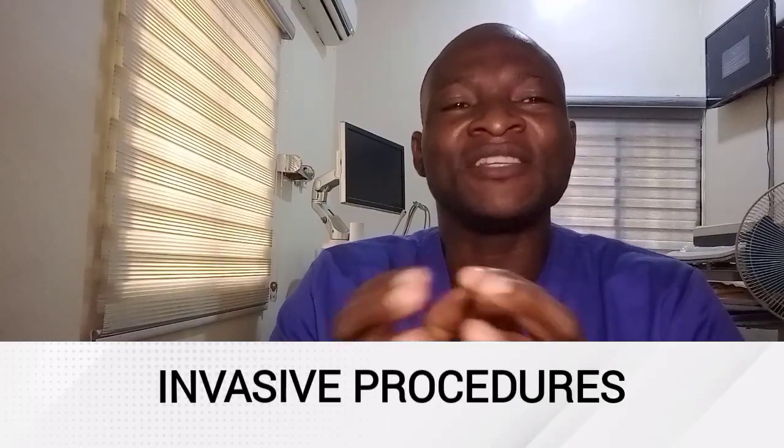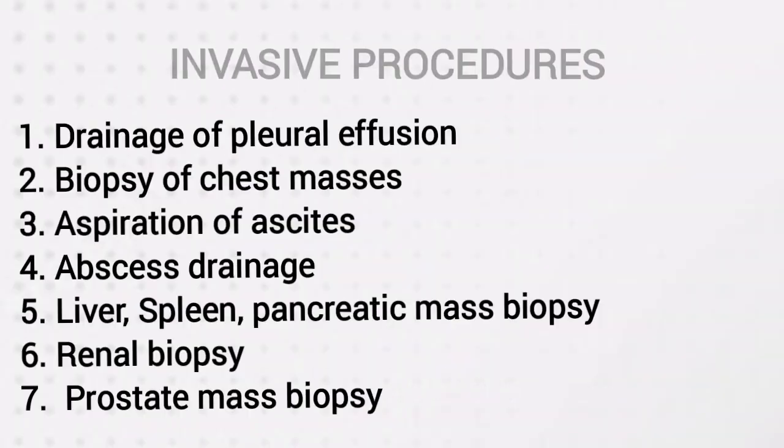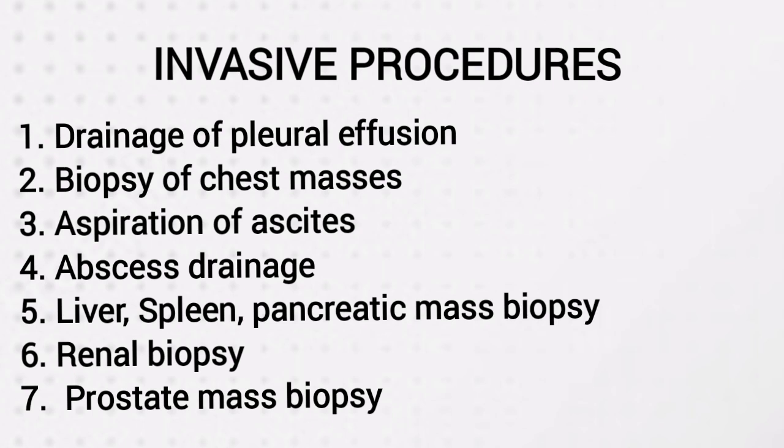Now let's look at invasive procedures. Ultrasound can be used to guide invasive procedures. Typical procedures in which ultrasound guidance is used will include drainage of pleural effusion, biopsy of chest masses, aspiration of ascites, abscess drainage, liver, spleen, pancreatic mass biopsy, renal parenchyma or renal mass biopsy, prostate mass biopsy.